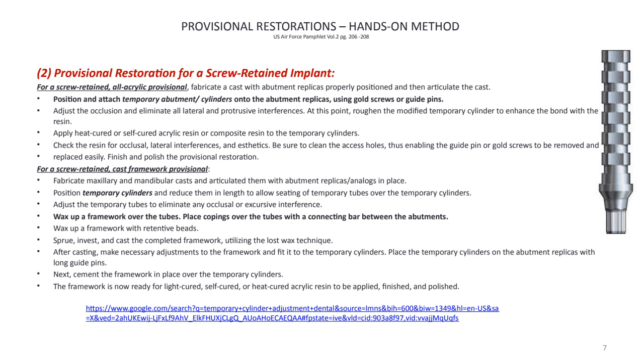So in other words, once we build up the tooth, the acrylic tooth or the composite, then we have to perform all the occlusal contacts or mesial and distal contacts, make sure that the contacts are closed, but also we have to keep in mind that the embrasures, especially the gingival embrasure, have to be open so the patient can use a proxy brush to clean.